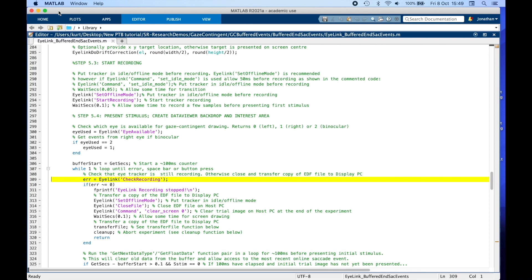We start a while loop and check that we are still recording. Within this while loop, we are going to run the GetNextDataType GetFloatData function pair for about 100 milliseconds before presenting the initial stimulus. By looping before stimulus presentation, we make sure we consume all older items in the buffer and catch up with the most recent ones issued by the tracker.